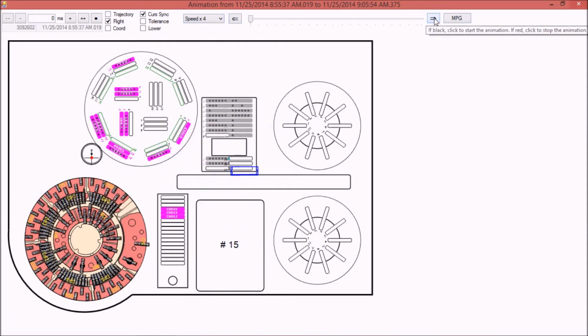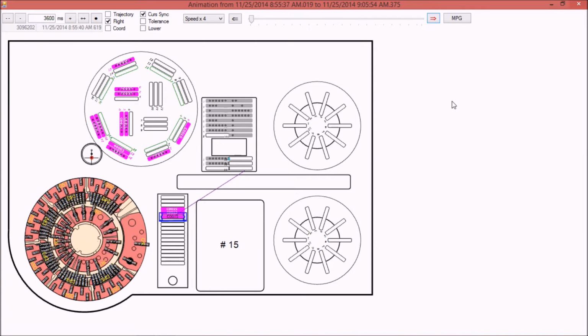This is not exactly a simulation, it is more precisely a real playback of what has been stored during the real testing issue. As you can see, the move is quite jagged, it's not very smooth. The reason for this is the low characteristics, the low quality of the processor used by this notebook. In a quad core, which we normally use, the move is absolutely smooth, and you will see probably an MPG output of this. We can move faster.